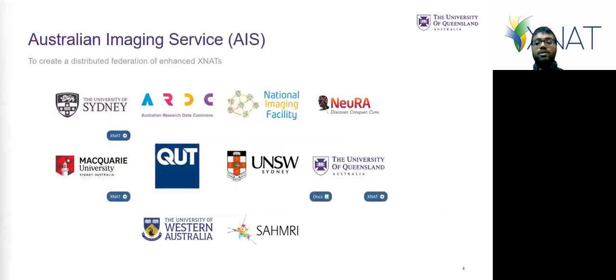So referring to the Australian Imaging Service, that's a project led by the University of Sydney. It was to standardize and integrate deployments of XNAT platforms across Australia. So these are all the current nodes of the Australian Imaging Service. And this project is basically building up a distribution of what we call enhanced XNATs. The project's still ongoing, so the nodes are at various stages of their deployments. And the UQ node has been in production since the end of last year.